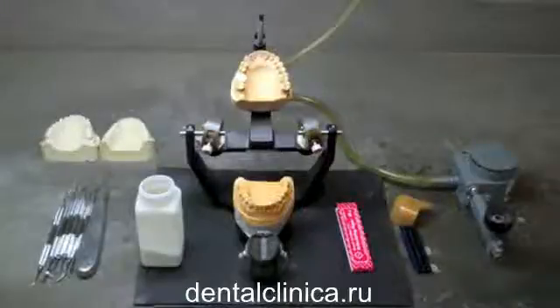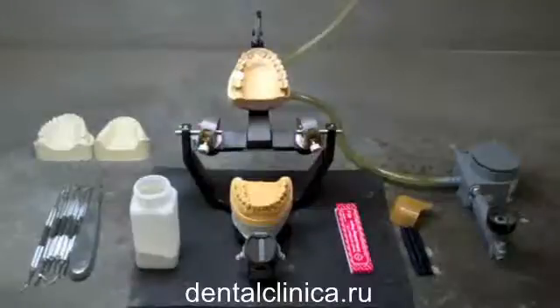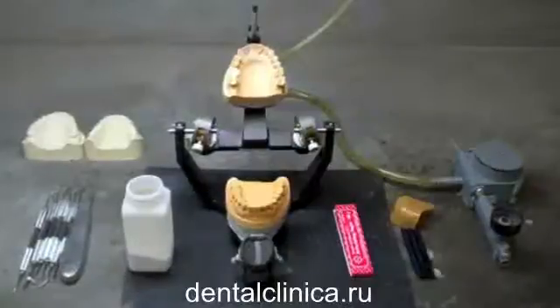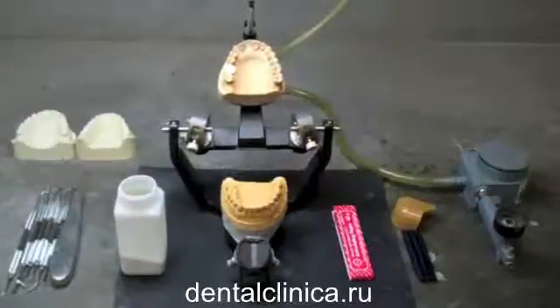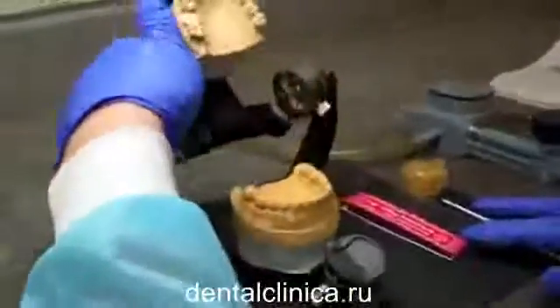For this exercise, you will need waxing instruments, morphology reference such as models, baby powder or aluminum oxide, your articulator and models, articulating paper, sticky wax, blue sculpting wax, and your Bunsen burner. First, we will start with tooth number 3.